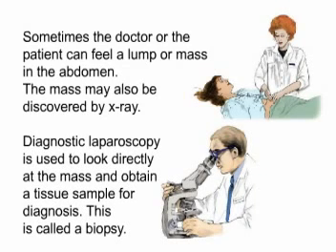Sometimes the doctor or the patient can feel a lump or mass in the abdomen. The mass may also be discovered by X-ray. Diagnostic laparoscopy is used to look directly at the mass and obtain a tissue sample for diagnosis. This is called a biopsy.